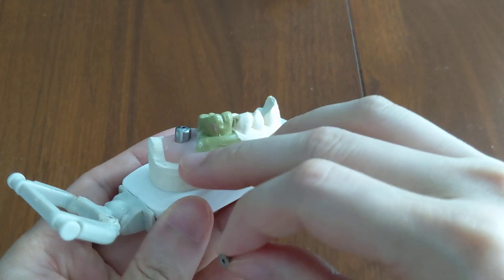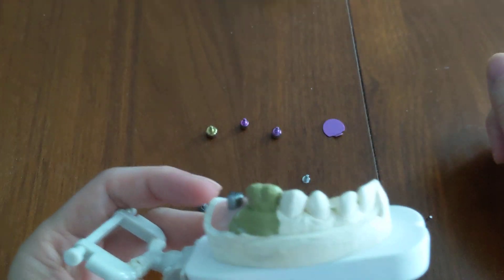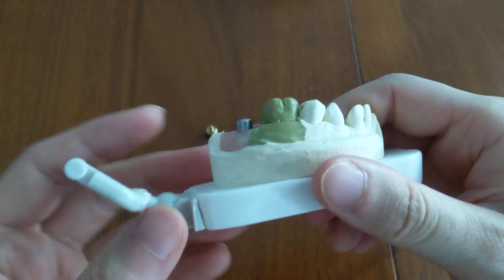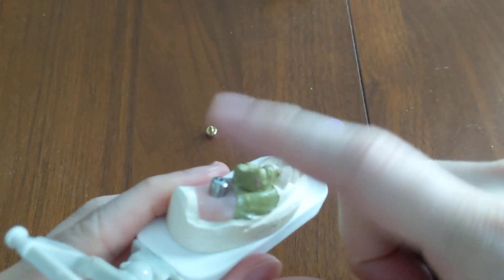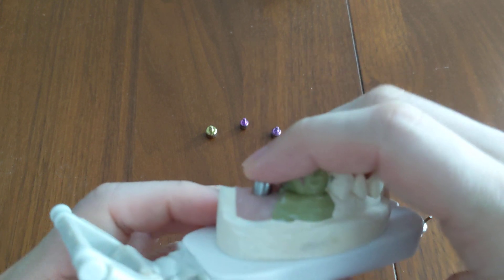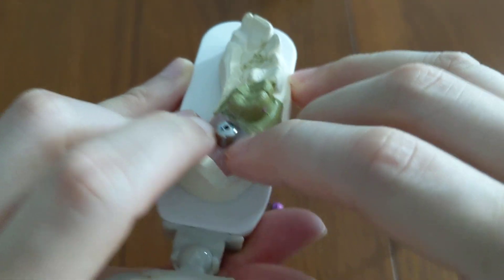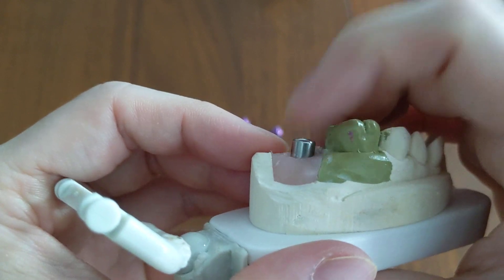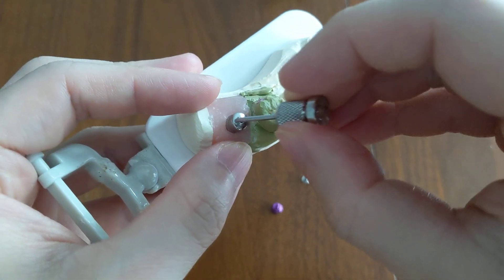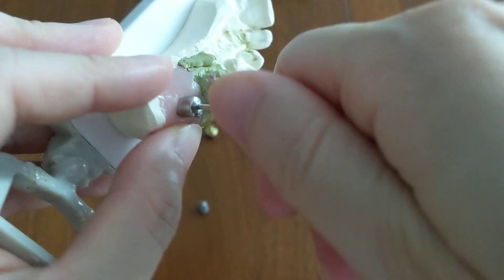The healing abutment is typically used after the cover screw. Immediately after the implant is placed, you put the cover screw on and leave the implant to heal undisturbed for about three to four months, sometimes up to six or eight months depending on the complexity of your condition. After that, when the implant is stable and ready to be restored, your surgeon will perform a stage two implant surgery — opening up the gums, exposing the implant, and placing the healing abutment.